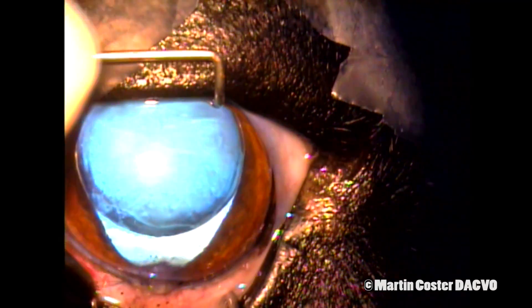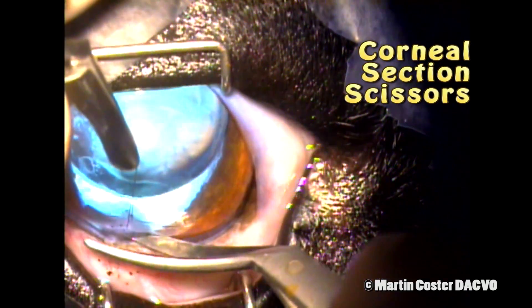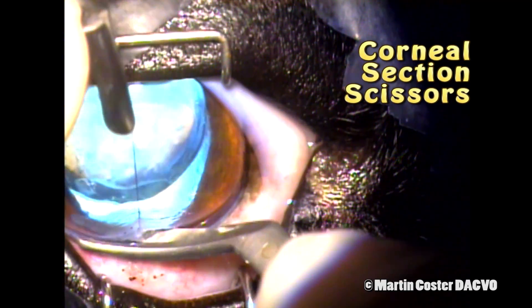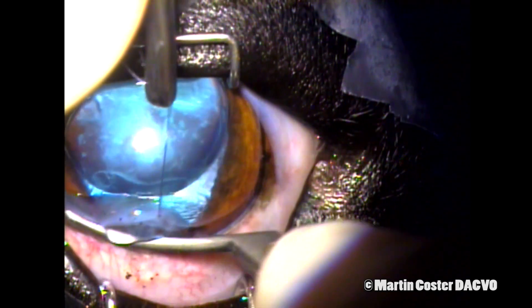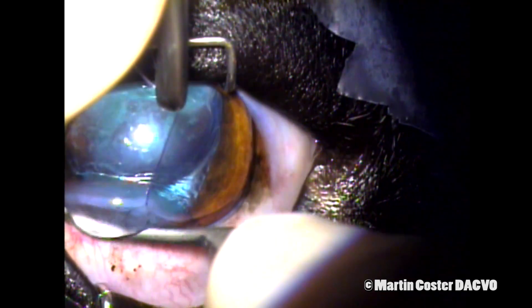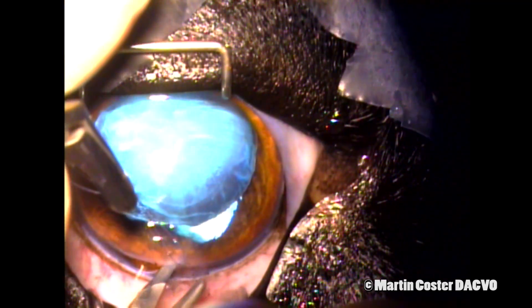This is an 8-0 Vicryl and we'll use that in our closure as well. I then use corneal section scissors to enlarge and complete the incision — these are scissors curved to go towards the left, and in a minute we'll go towards the right. You'll see aqueous humor being released from the incision as well as more vitreous humor.